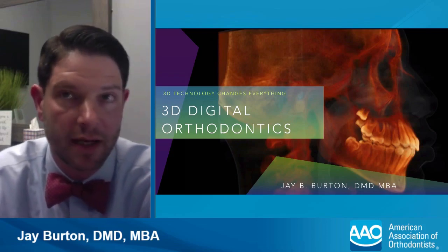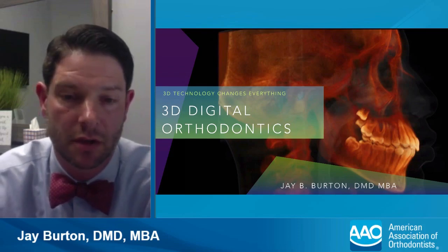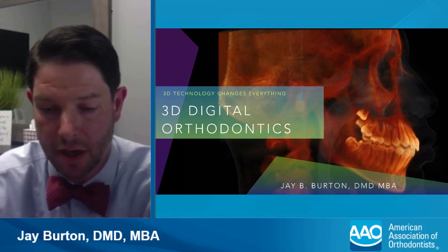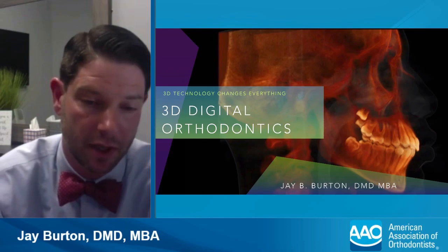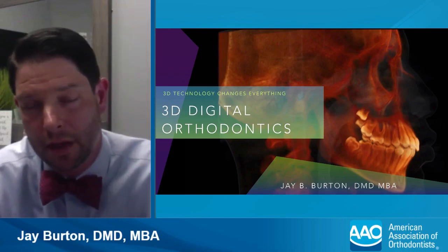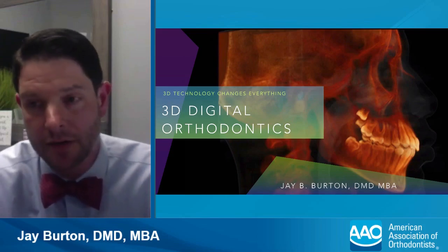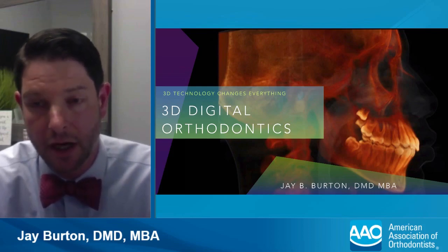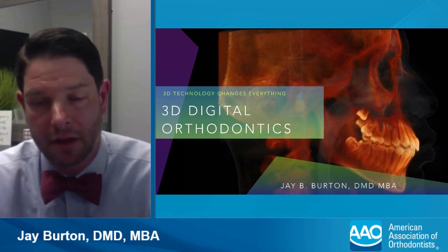So for me, what I did is I referred out my CBCT imaging to an oral surgeon until I was referring out enough patients every month to make a payment on a machine, which it doesn't take long. The average orthodontist is seeing about 20 starts a month. If you just increase either your records fee or your overall fee by $100, which isn't that significant, the patients aren't even going to notice it, you're going to easily pay for the cost of the machine.